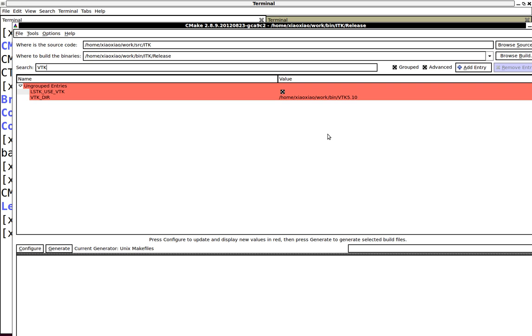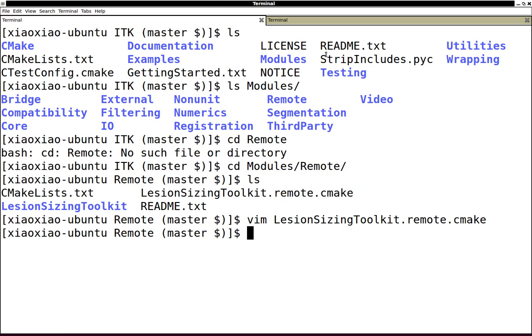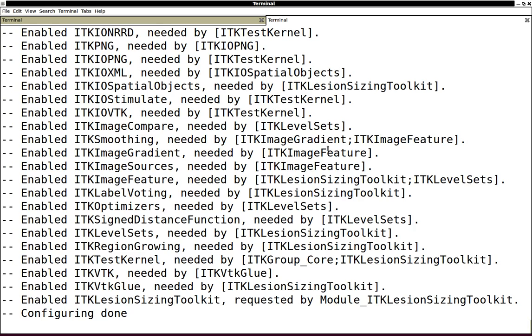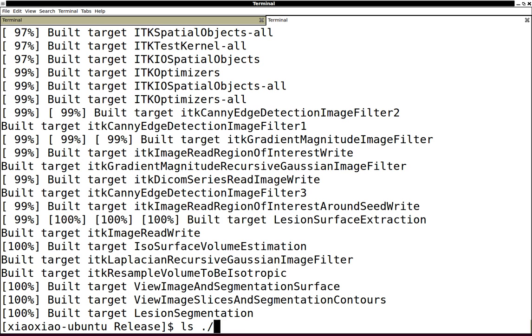After that, this is my build tree. Everything should be all set. By the end, you will see an executable named lesion segmentation in your bin directory.